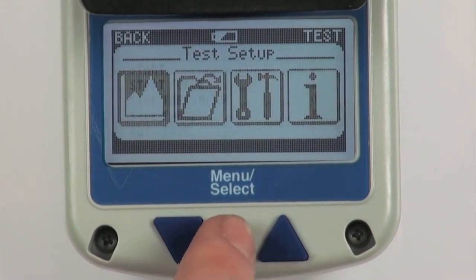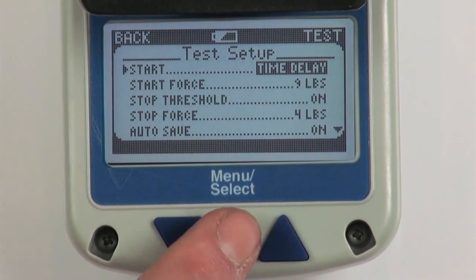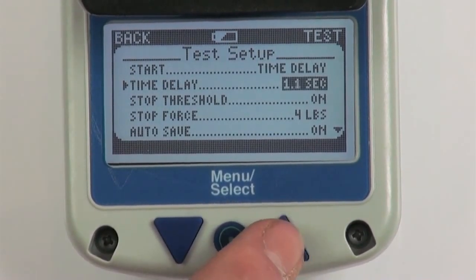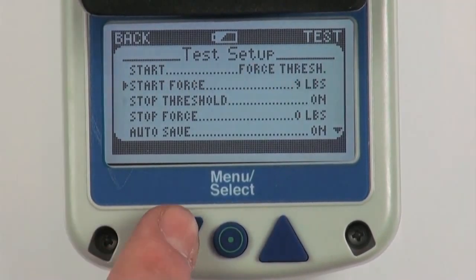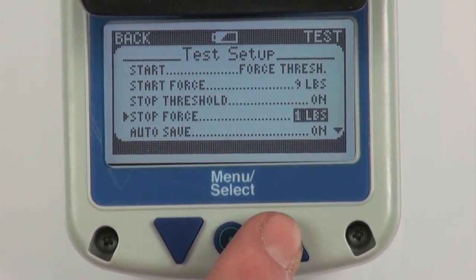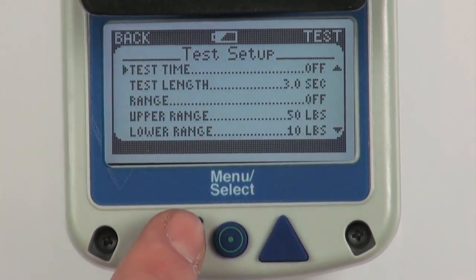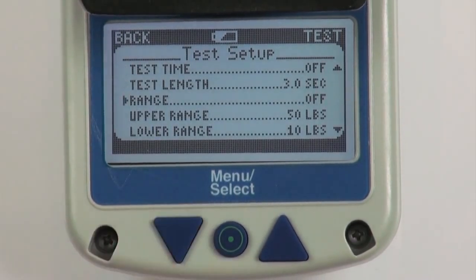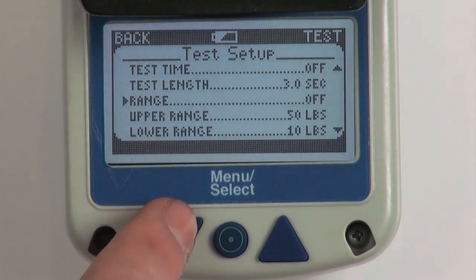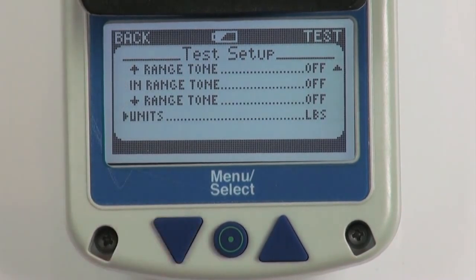The test setup menu screen allows the user to set up various test options. Starting a test can either be done by passing a force threshold or after a certain time delay triggered by the top button. The options allow you to select customized force thresholds and time delays. This screen also allows you to enable a stop force — if enabled, each test will stop when this threshold is reached; if disabled, each test will last the amount of time set by the test time option. The test time option lets users select a preset time for testing. The range options allow an upper and lower range to be enabled, set by configuring the upper and lower range values. Range tones are enabled by turning on each corresponding tone.